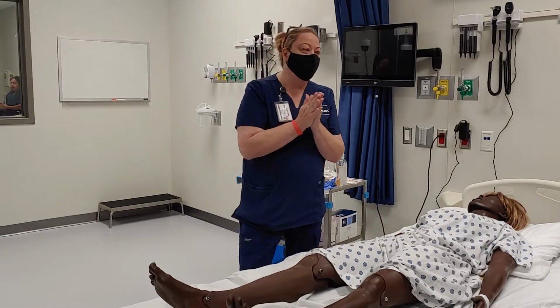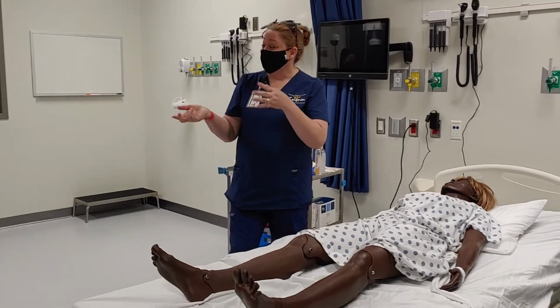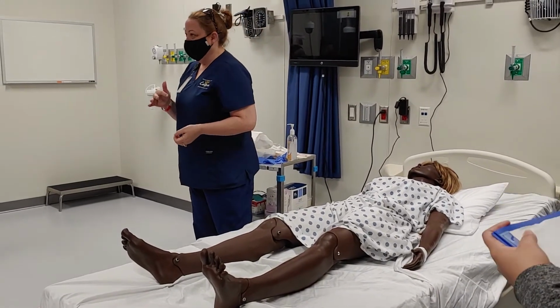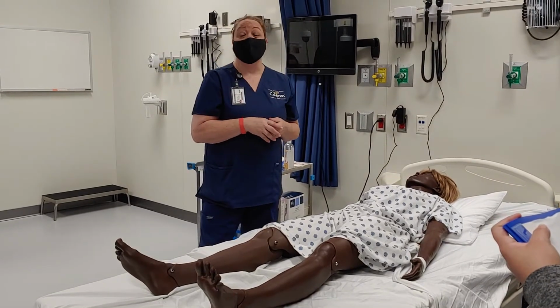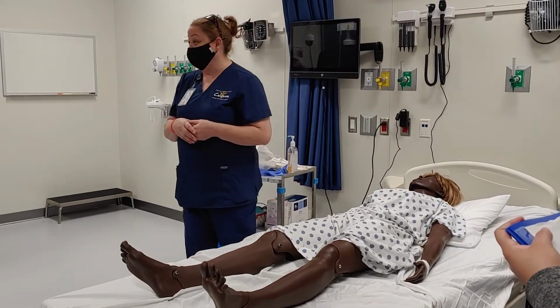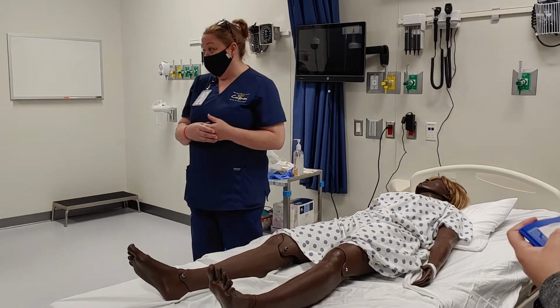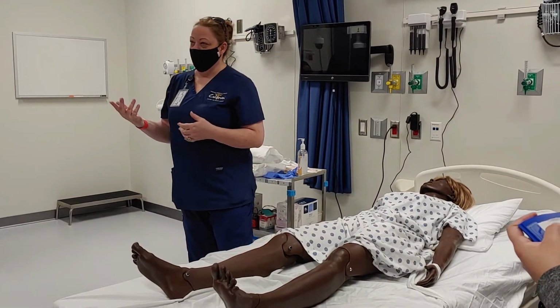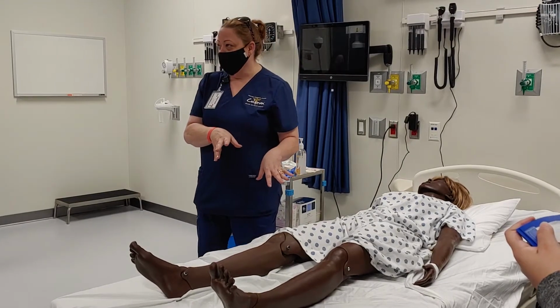To get out of today is the procedure for doing catheterizations, right? I'm going to demonstrate the female catheterization online on Module 7. You'll see that there's a YouTube video for catheterizing a guy. Imagine this, but it's much easier to catheterize a man. So that's why I wanted you guys to see a little bit more challenging on the female, okay?